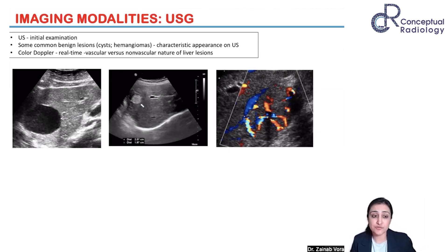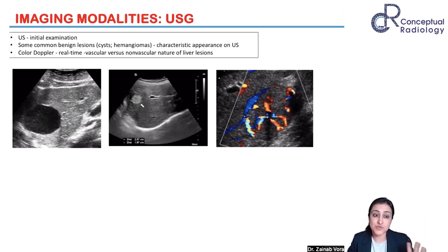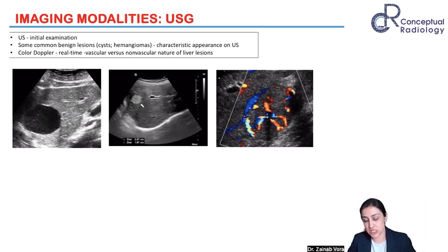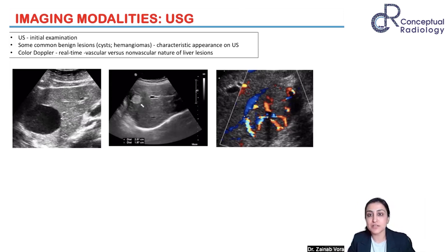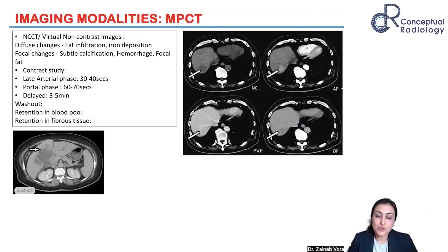Infectious causes can also be best assessed on ultrasound. When you see a hyperechoic lesion, it favors a diagnosis of hemangioma. So ultrasound gives very typical appearances for cysts and hemangiomas, helping you narrow down, particularly when it's an atypical hemangioma on CT or MRI. Doppler also helps assess the vascular nature — when you see a central spoke-wheel pattern, you start thinking of FNH. Ultrasound really helps narrow down certain features very well.